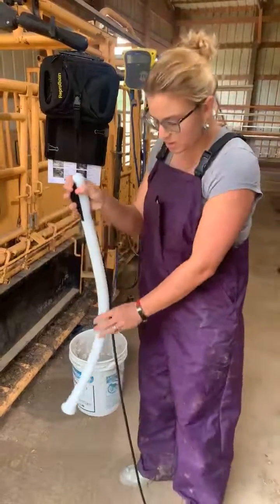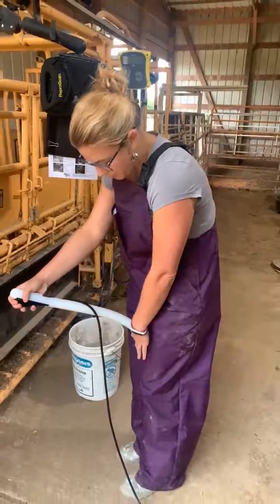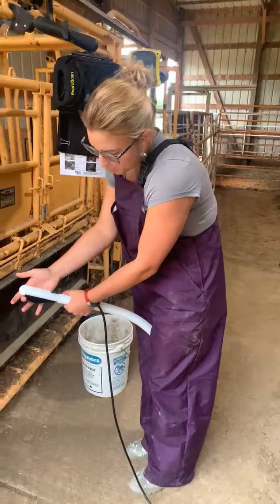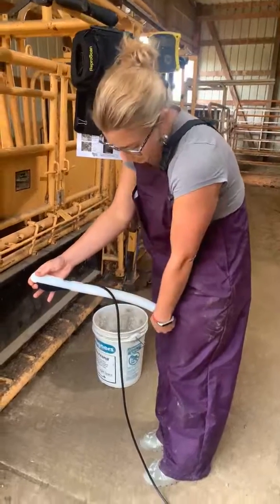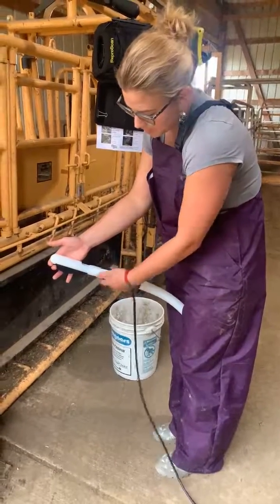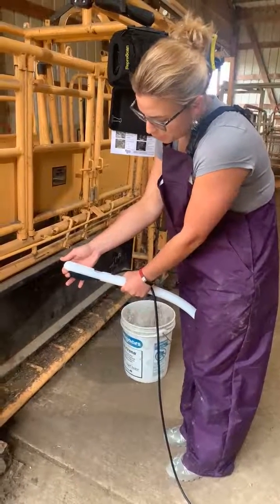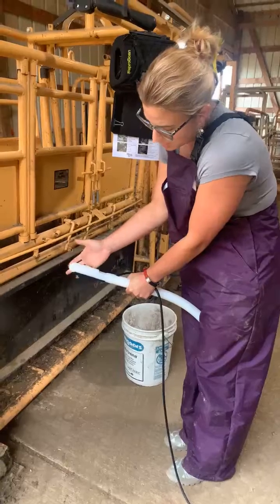There are a couple different ways to do it, but I cheat a little bit. I put the bottom of the probe by my knees, then I'm holding the repro arm — holding the probe with my middle finger — and I'm going to pull with my index finger. So I push with my left hand and pull with my index finger to straighten that out.